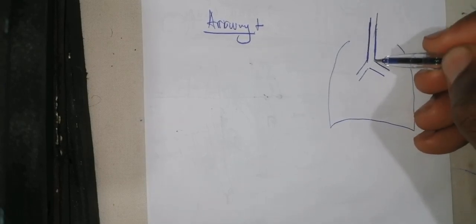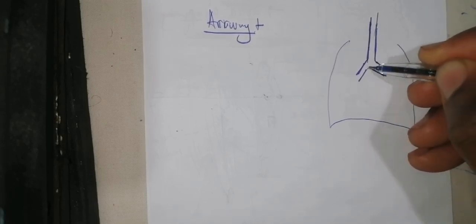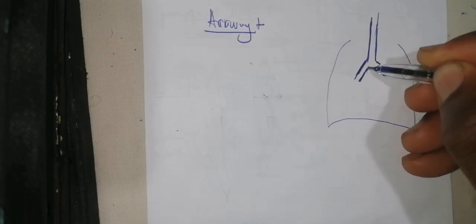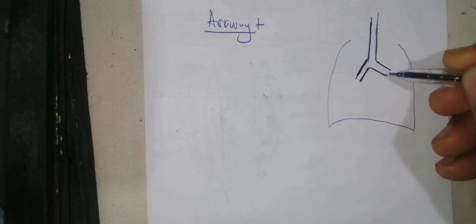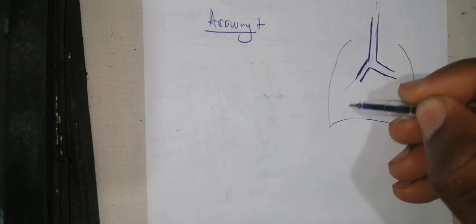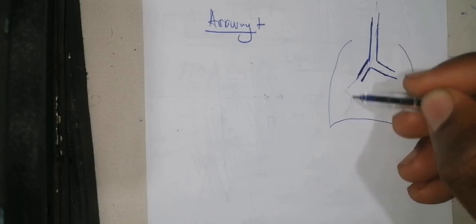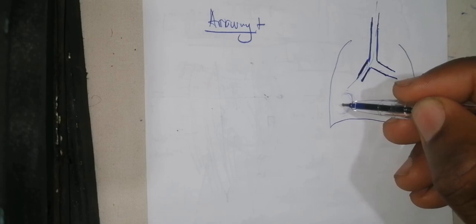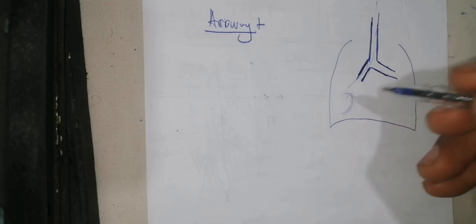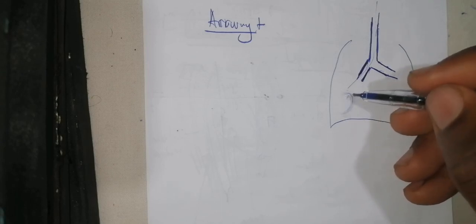and then you descend to visualize the two bronchi. Is it clear? I've drawn it in this way because the right bronchus is shorter and straighter as compared to the left bronchus. That's why when there is aspiration, it's going to cause consolidation syndrome, or opacities located at the level of this location in the right lower lung field. You're going to visualize heterogeneous opacities here.